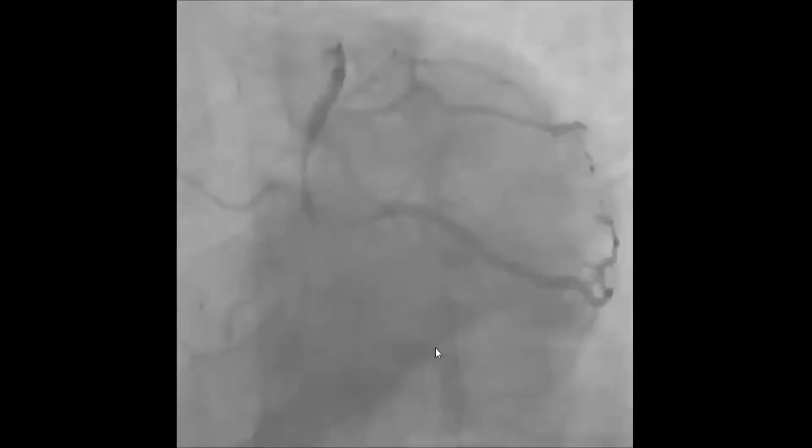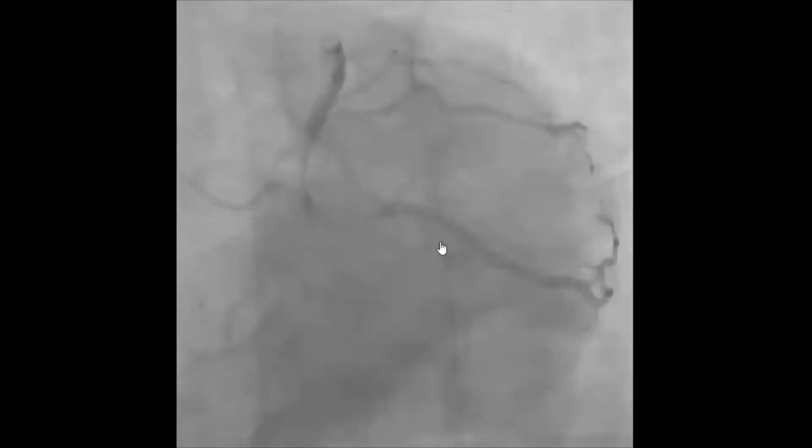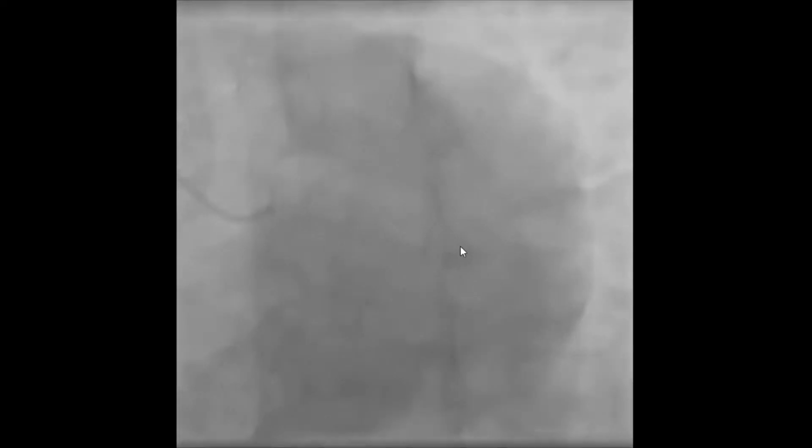So looking at this, you can see the vertebral column up there, and the rib cage inclination is this way. And try and see the diaphragm. You can still see movement of the respiration, but you don't see the diaphragm. You don't see the diaphragm.